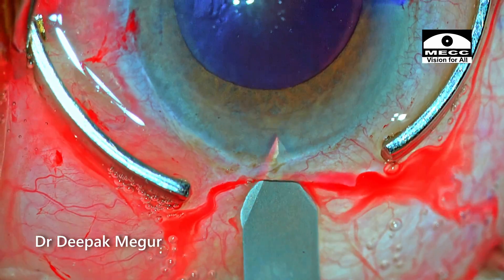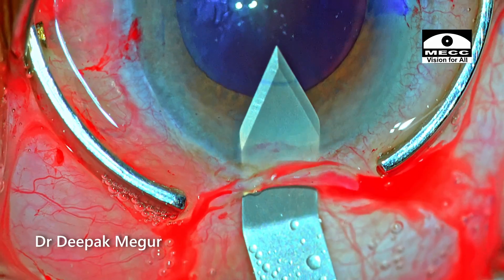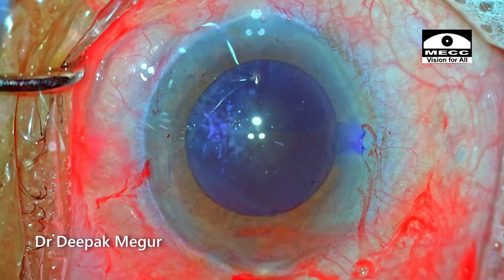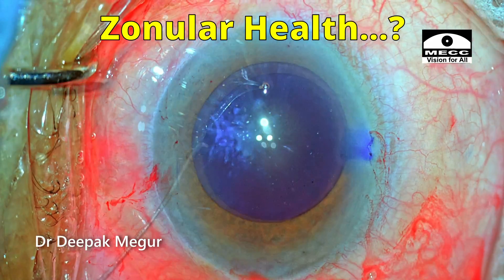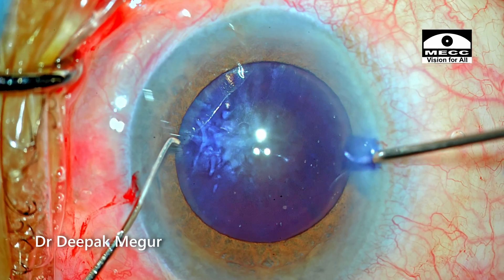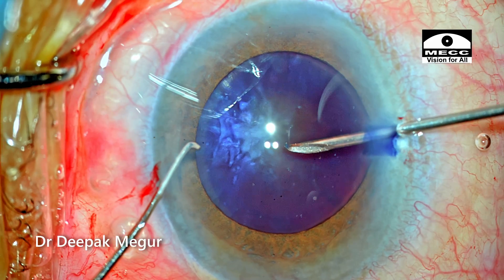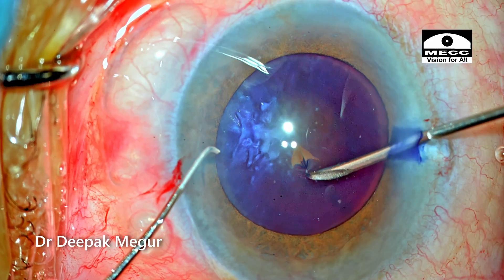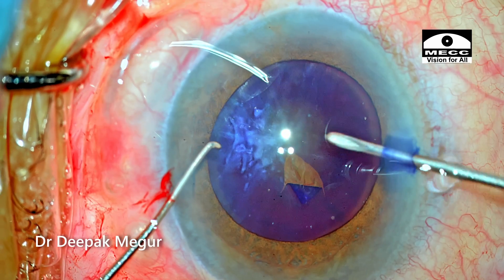The question ringing in my head at this point is the status of the zonules in this case. The moment I touch the capsule with my needle, I'll get an idea of the zonules, which will indicate the prognosis and ease of doing surgery in this eye. Using a 26G needle I make the initial puncture, and to my relief, it looks like the zonules are quite healthy.